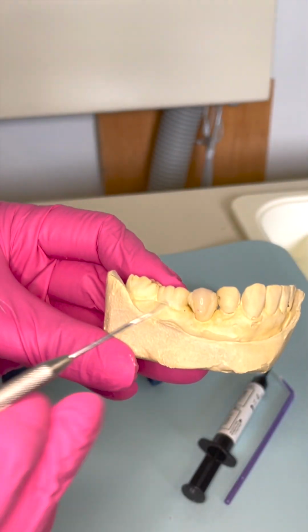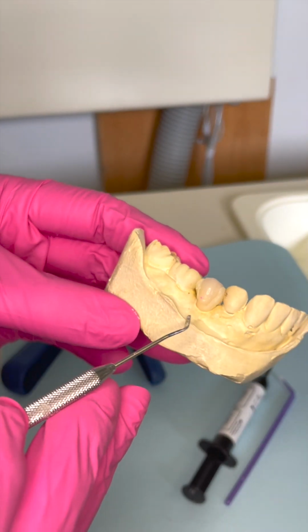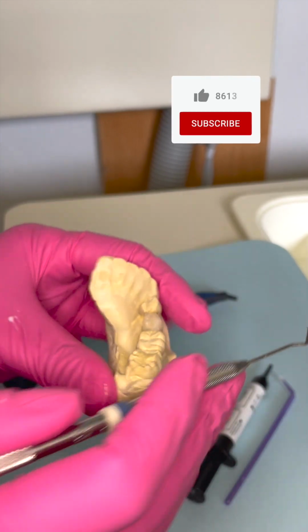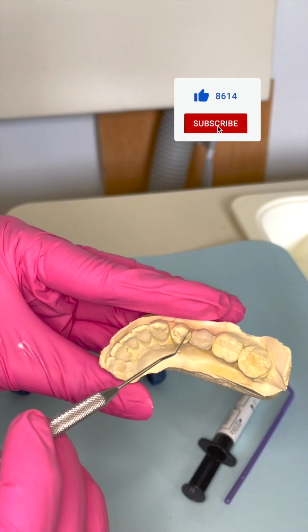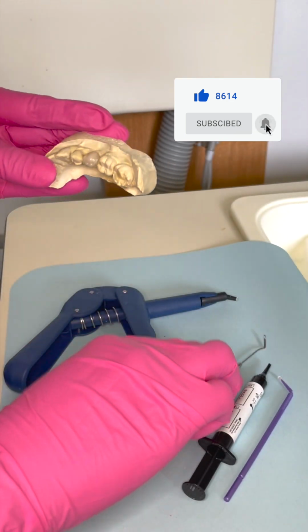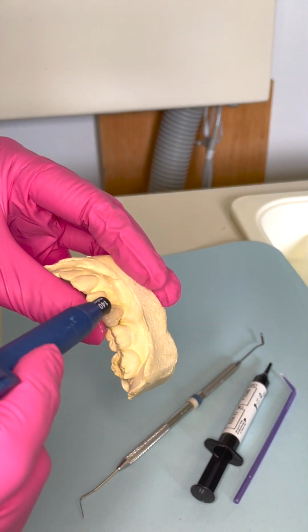Take a close look at the embrasure areas. You don't want them to be as open as they look right now, so we gotta close them up a little bit. And you can always open them back up if the floss thread doesn't go through when you're trimming the temporary bridge.